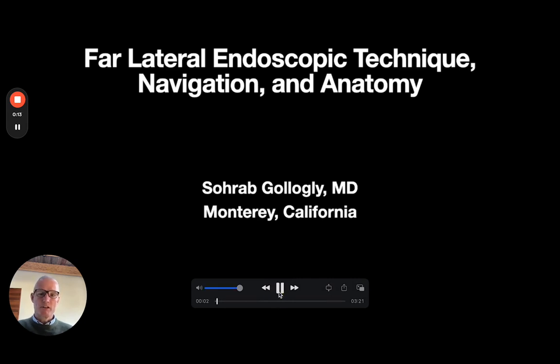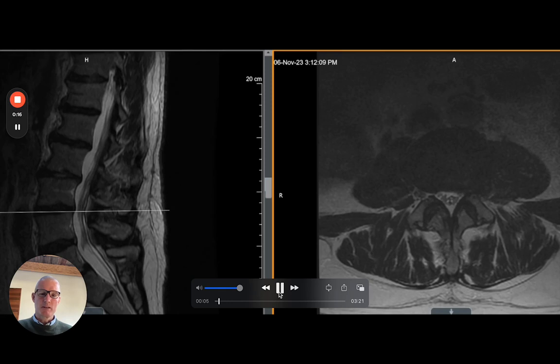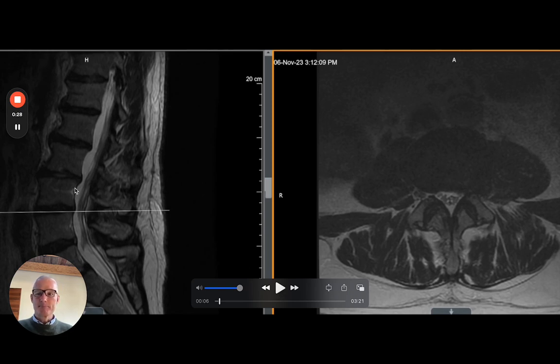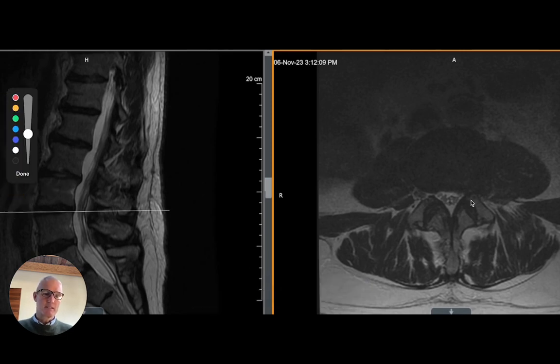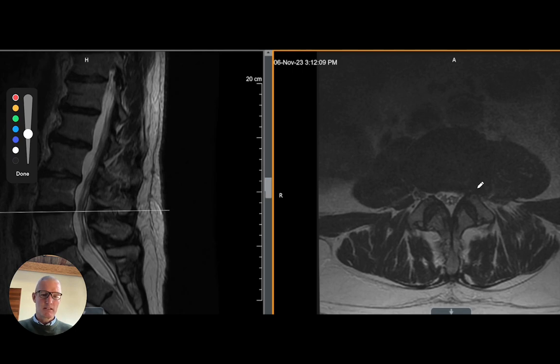In my personal opinion, this is a very good case to do early in the learning curve because the pathology is located outside of the foramen and therefore you don't need to traverse through the foramen. A foramenoplasty is not required and in general you're staying outside of the spinal canal. This is a far lateral disc herniation located at the L3-4 level on the left side causing a concurrent radiculopathy that has not responded to conservative care.